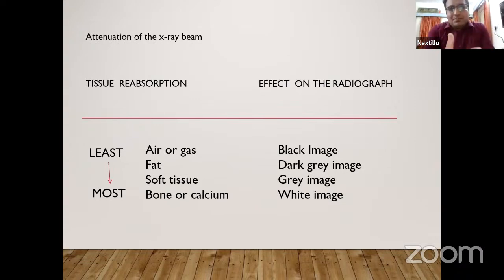Same concept with barium contrast, like barium studies. You must have seen esophagograms and others. That paste, that barium, is quite dense. So it will attenuate more X-ray, so less X-ray will reach the film and it will appear white.